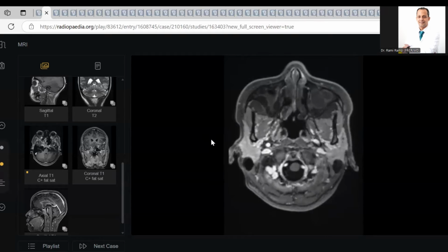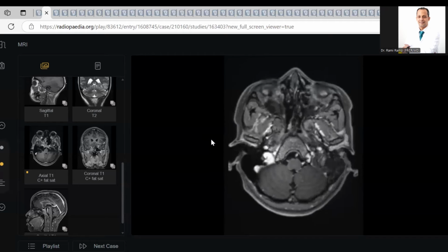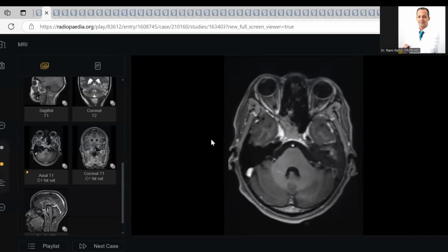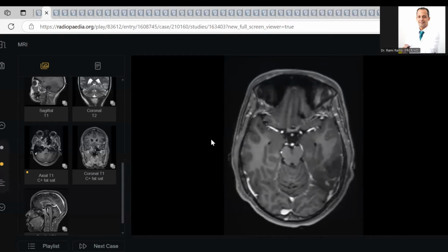Include. What's your one minute left. Okay. What's your diagnosis, please? The diagnosis is left temporal lobe encephalitis with maxillary sinusitis and left transverse sinus thrombosis and otomastoiditis.